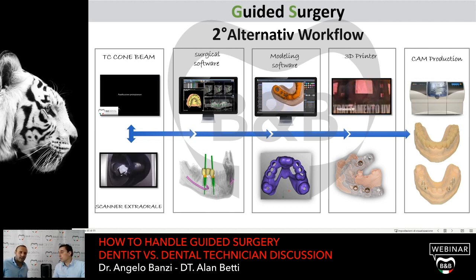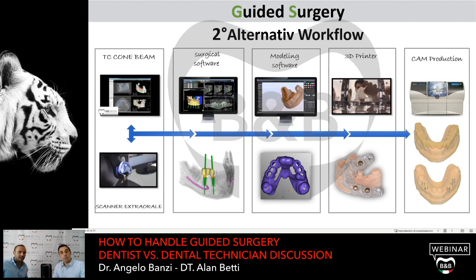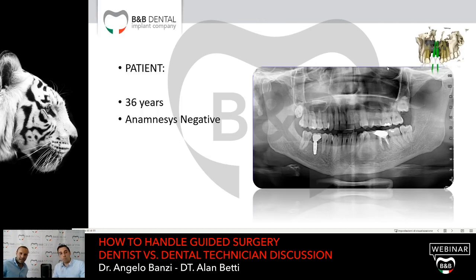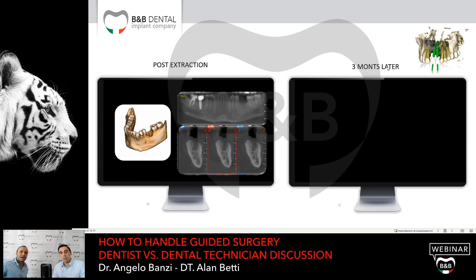The CBCT comes from the CT scan, and the second file comes from the laboratory scanner. Yes, let's see this patient.